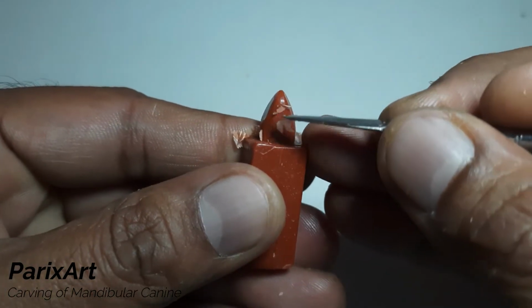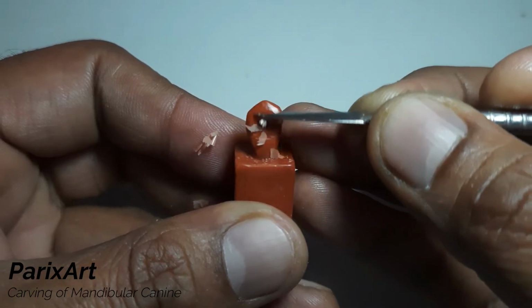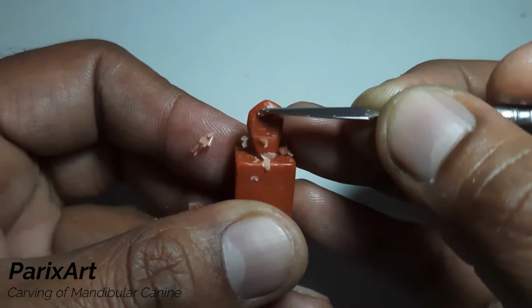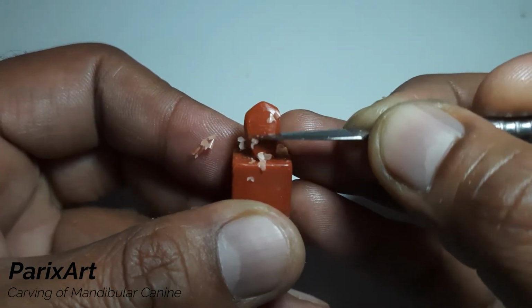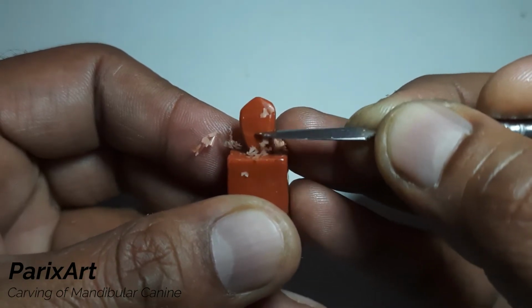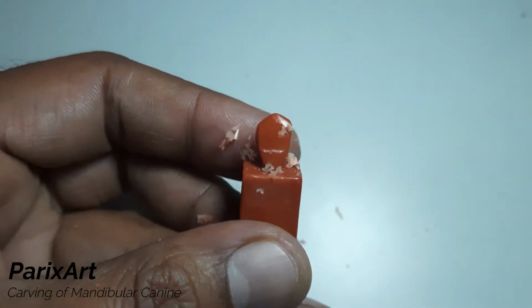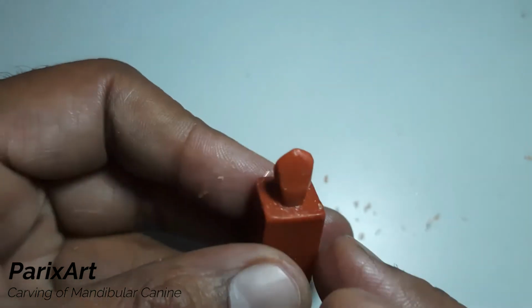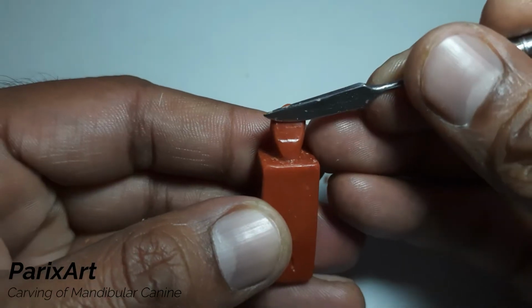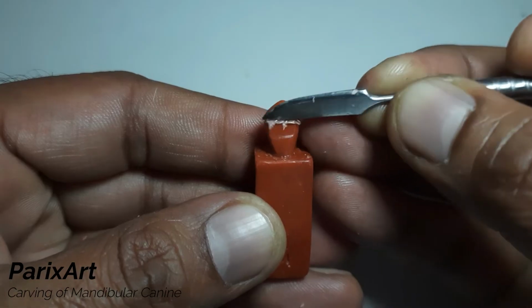See the slight concavity being developed. Also start blending the concavity with the cingulum.